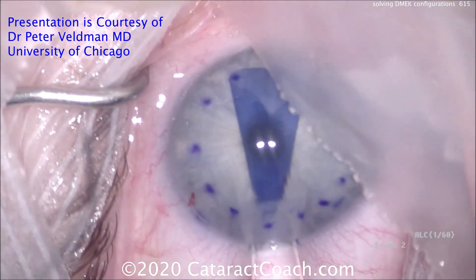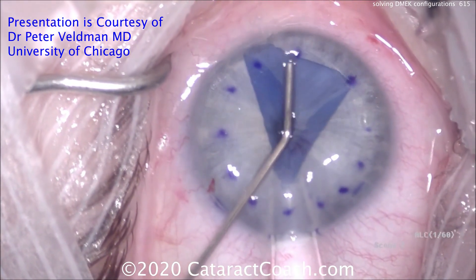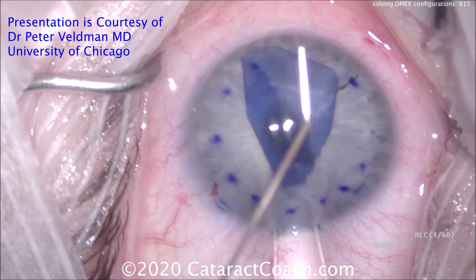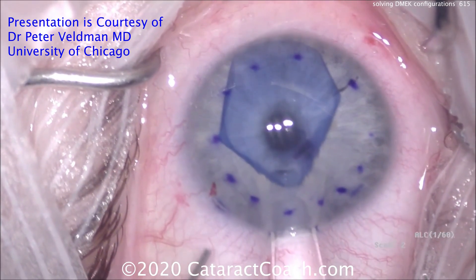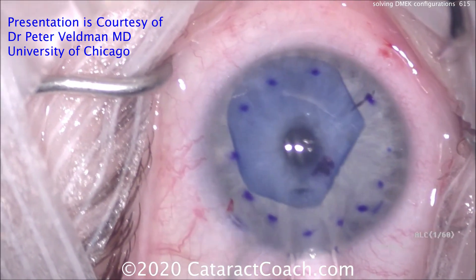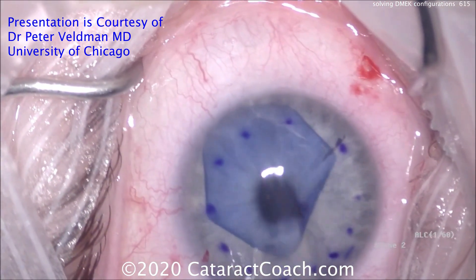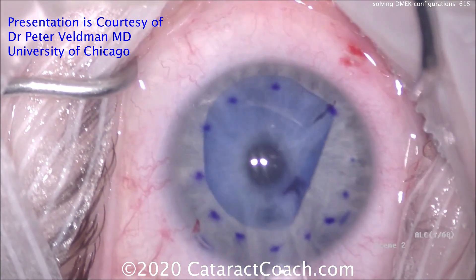The Jones tube remains at the incision. Tapping right in the center sends small fluid waves across to help open the graft, and flattening the anterior chamber further helps. Tapping the center causes the graft to open more, unfolding the edges and tapping it into position. The letter 'F' mark confirms correct orientation — the graft is not upside down.